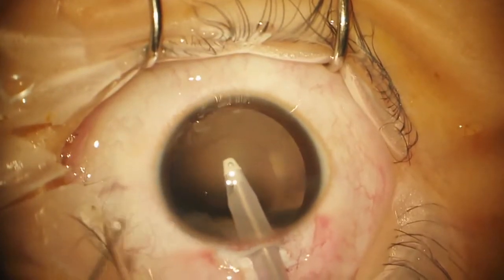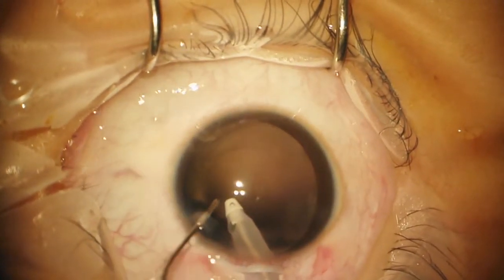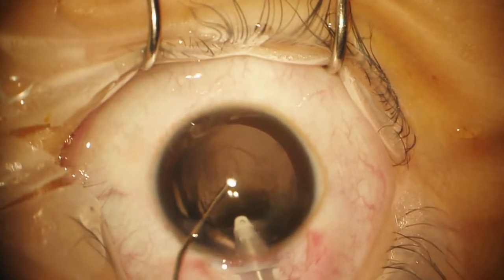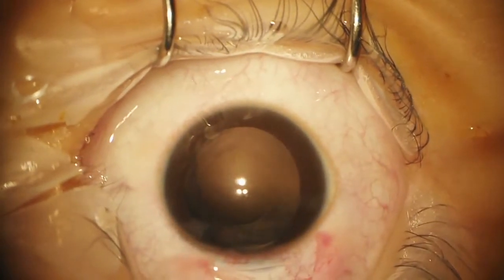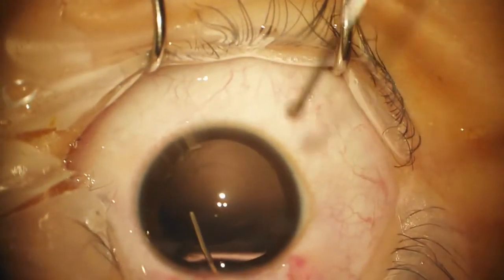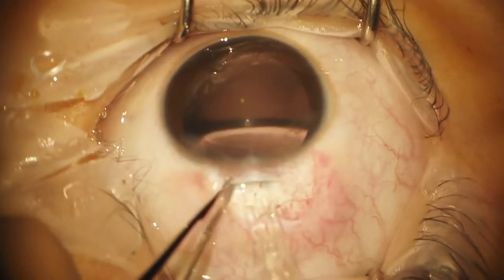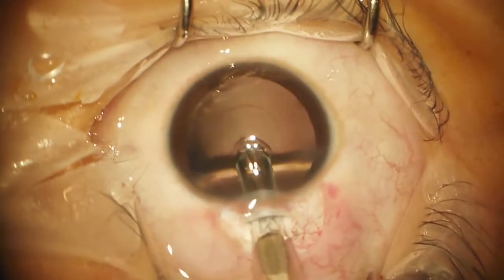Rather than just pull out of the eye, I'm going to insert OVD right now so that there won't be a collapse. That way, if there was a weakness in the capsule, the collapse of the eye won't cause the capsule to break. Now we'll put the lens in — you should always look at the lens in the cartridge to make sure the orientation is correct and that the haptics are tucked.